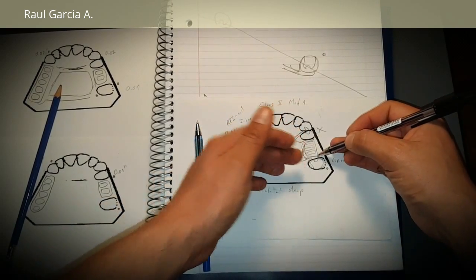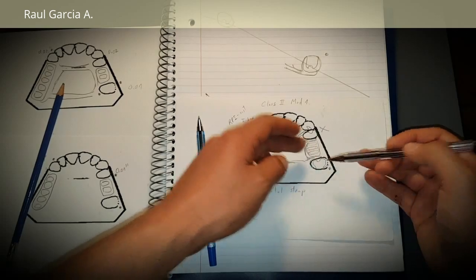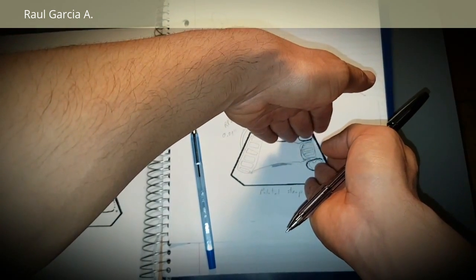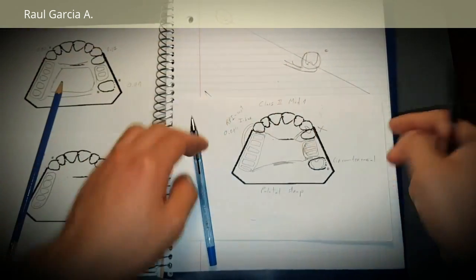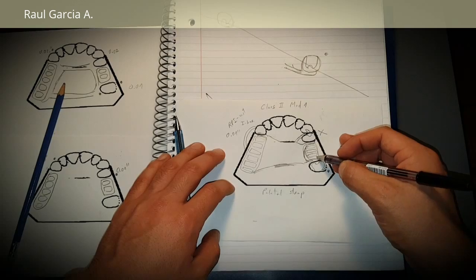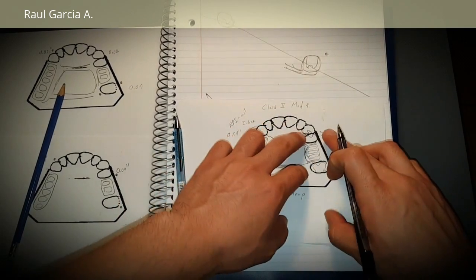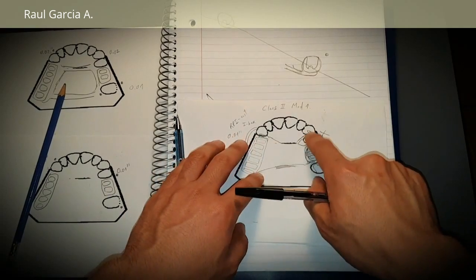next to saddle areas. So I can put a guiding plane here, a guiding plane here, and a guiding plane here. So the path of insertion of the RPD is gonna be just this. So it's gonna fit there exactly. Good. There and here. Okay, path of insertion. Good. So you can draw your guiding planes. This is the open lattice work. And then you say I cannot put anything here. So we will see that later.